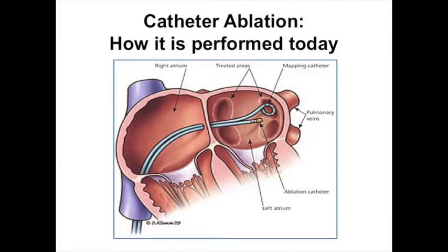The device in this illustration is a point ablator catheter that is the most frequently used technology for PVI. This catheter allows the physician to remotely control the ablator tip to make multiple overlapping points around the pulmonary veins. The procedure is long and tedious to perform.